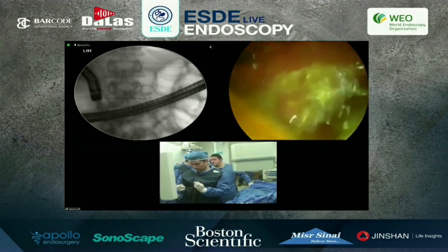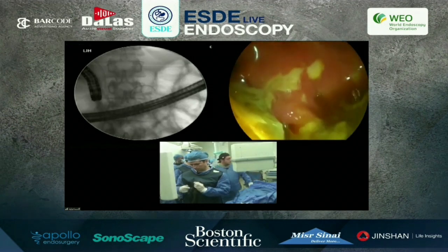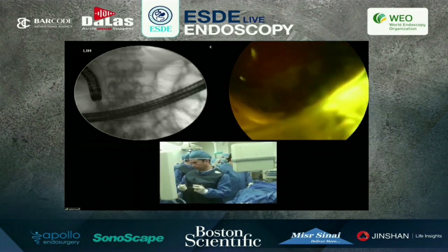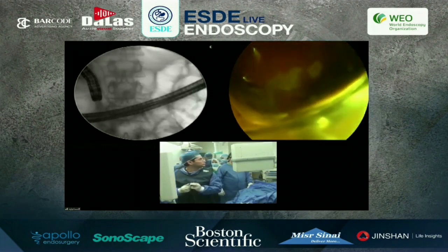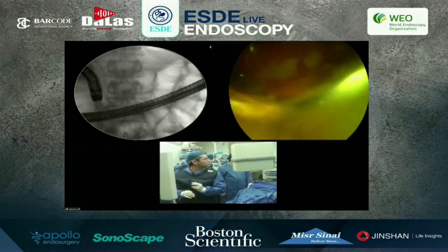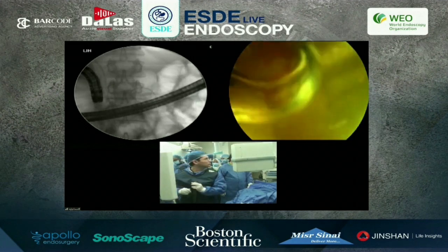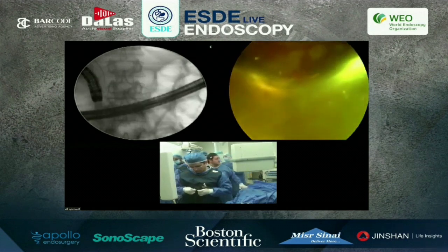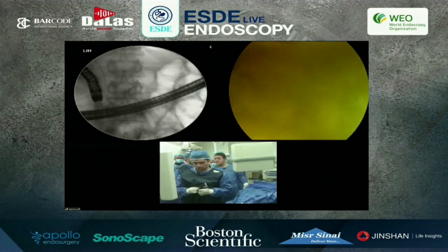I think an important point here, especially for the trainees in the room, is that, as was excellently demonstrated here, you always try to decompress the bile duct before you place a duodenal stent, because you're going to jail off the ampulla when you do this. So in most cases, unless you place it very carefully, it was very nicely done to do it in this order. Thanks. Absolutely.